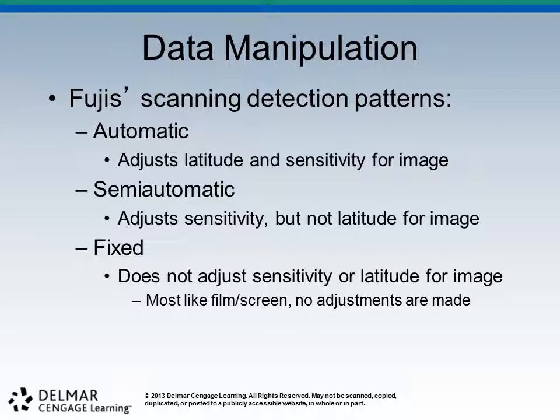But in clinical, this is probably what you're going to see always. The raw data will still be there, but the computer scales it to some predetermined set. Everybody's agreed this is what we want to see, and the computer will make it fit that. Again, try not to be too detailed about it because it really doesn't deserve it.